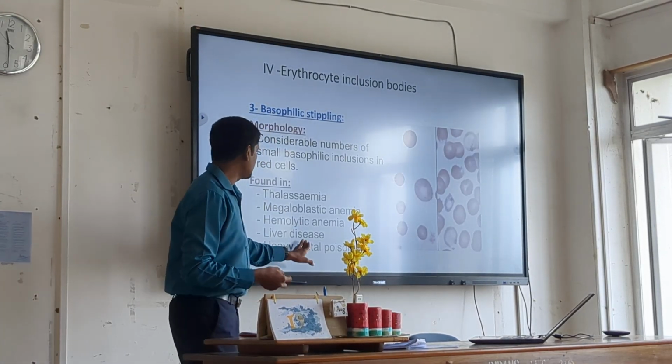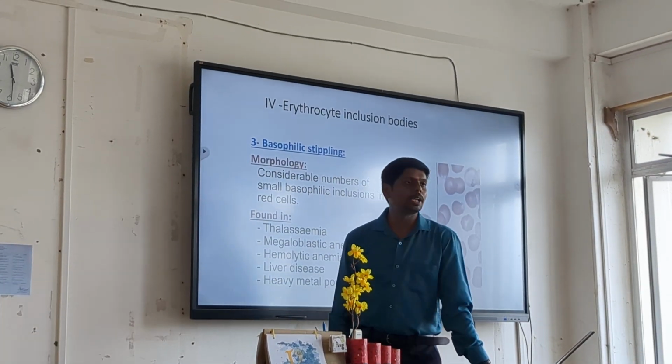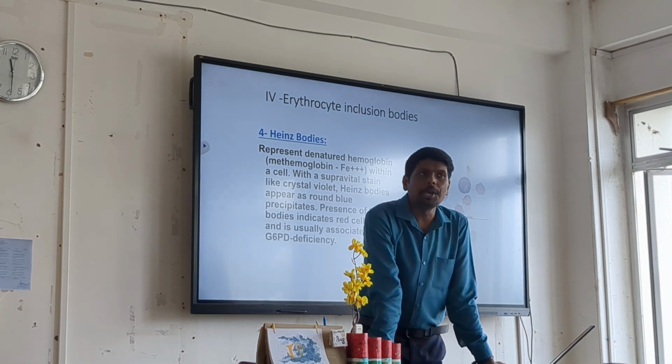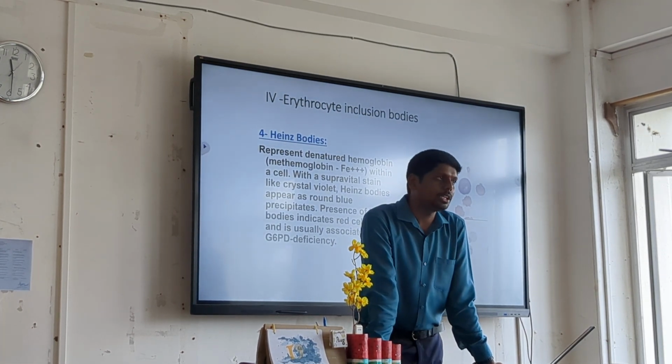And other reasons are the hemolytic liver diseases. So in such conditions, we will see basophilic stipplings. Is it clear? Next one. Heinz bodies, very, very famous. Just like Howell-Jolly in the hematology.